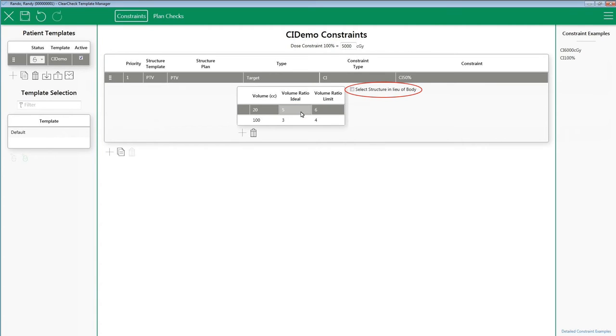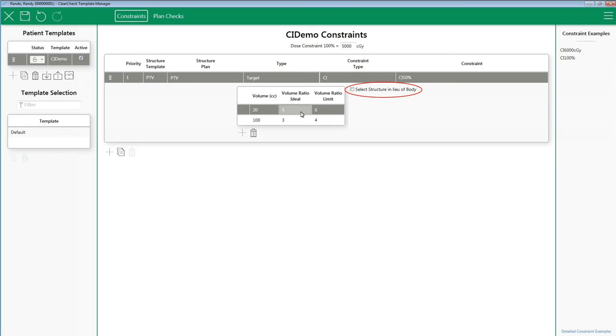Lastly, you may have noticed this box that says select structure in lieu of body. If you are dealing with a single target, it is advised not to change this setting. This ensures that the entire volume of an isodose line in the body and calculation grid will be accounted for. This setting is generally used for a special case in which you have two or more targets that are on the same CT dataset and far apart.